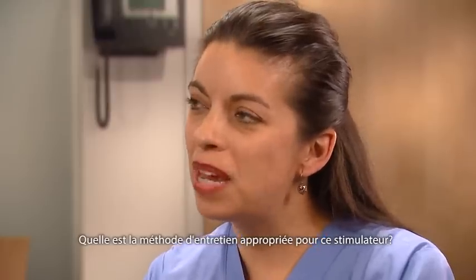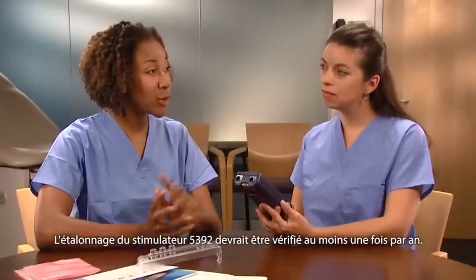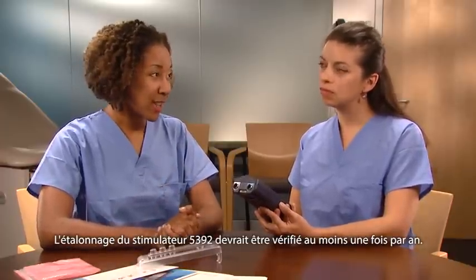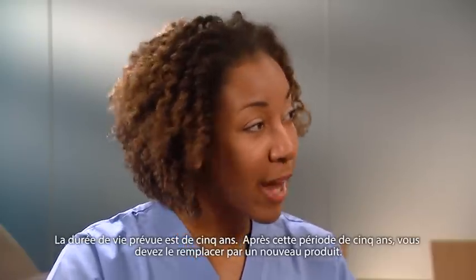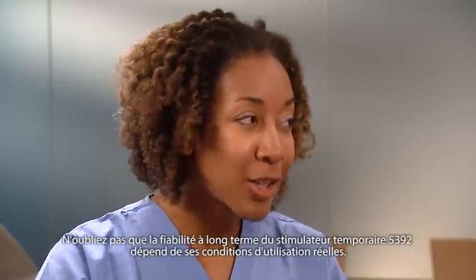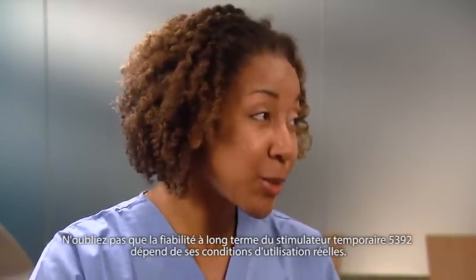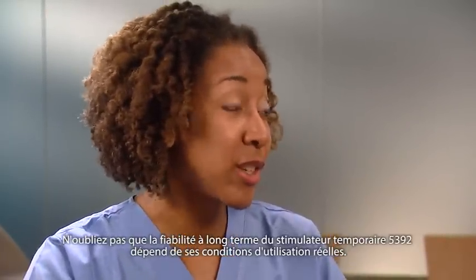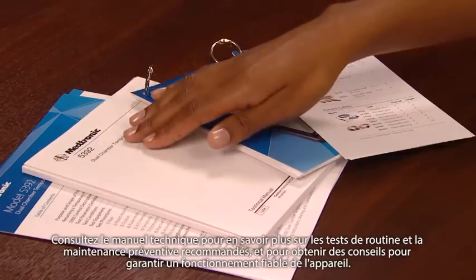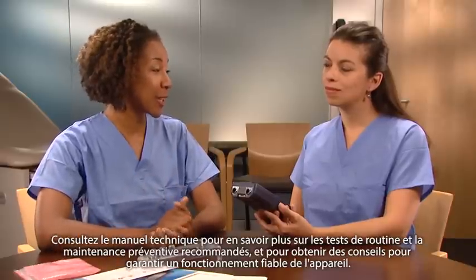How should I maintain this device? Calibration of the 5392 should be verified, at minimum, once every 12 months. The expected service life is 5 years. After 5 years, you should replace it with a new product. Remember that long-term reliability of the 5392 temporary pacemaker is subject to the actual use conditions of the device. Look at the technical manual for recommendations on routine testing, preventative maintenance, and other tips for reliable operation.